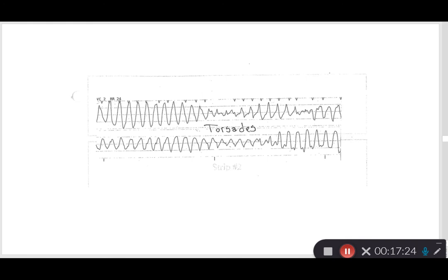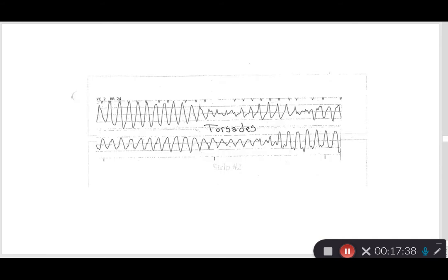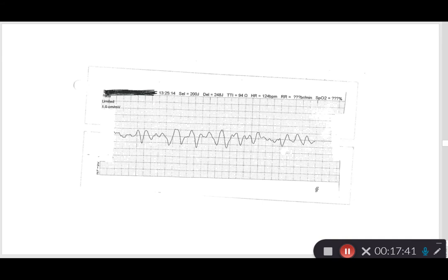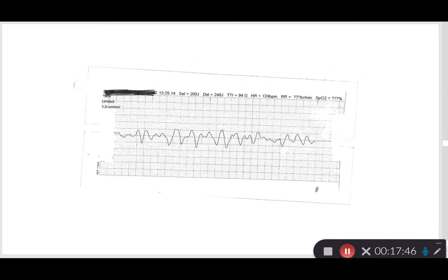All right. Obviously, we know what this one is because it's written right there. I couldn't really get rid of that. This is torsades de pointes, and a lot of people confuse torsades with VFib. All right, I'm going to move to the next slide. This is a VFib. So when I flip back and forth between these two rhythms, we can see that they are extremely different. With the VFib, it's very wide and bizarre, so we'll just go ahead and label that one while we can. I can't even count a rate. It's impossible. This is not sustainable with life.